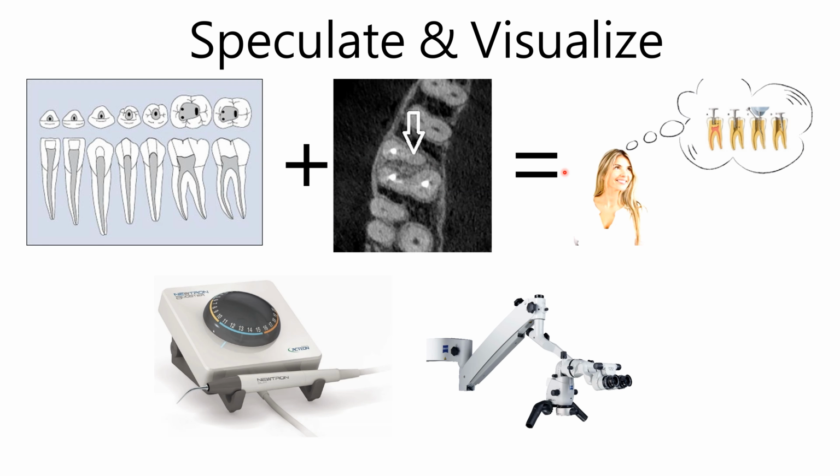But our problem is we still have to speculate and visualize to do the endodontic treatment when we have no digital instruments, without digital tools.